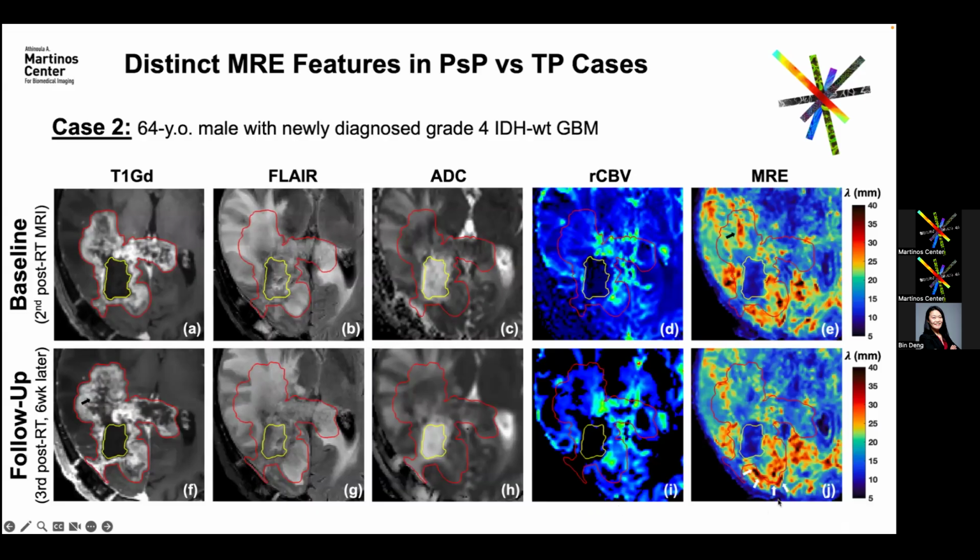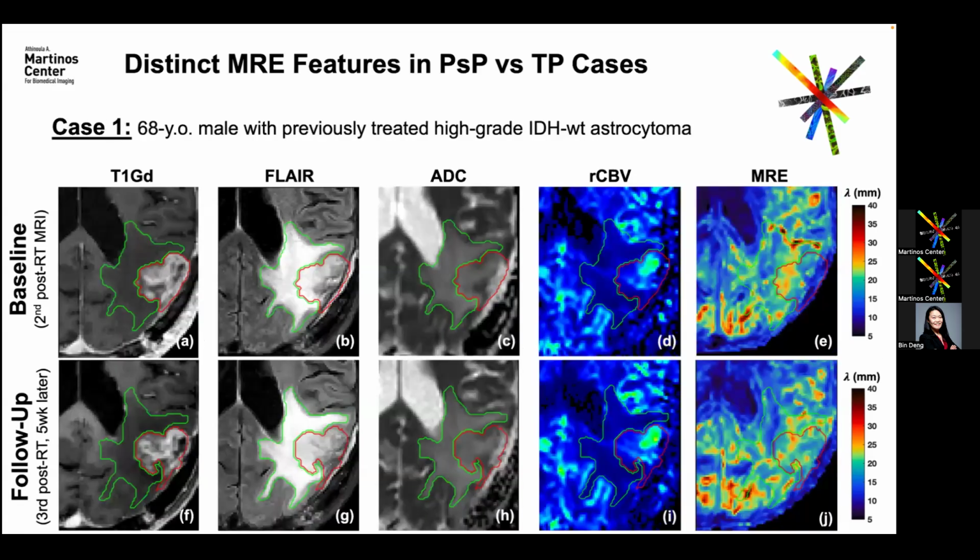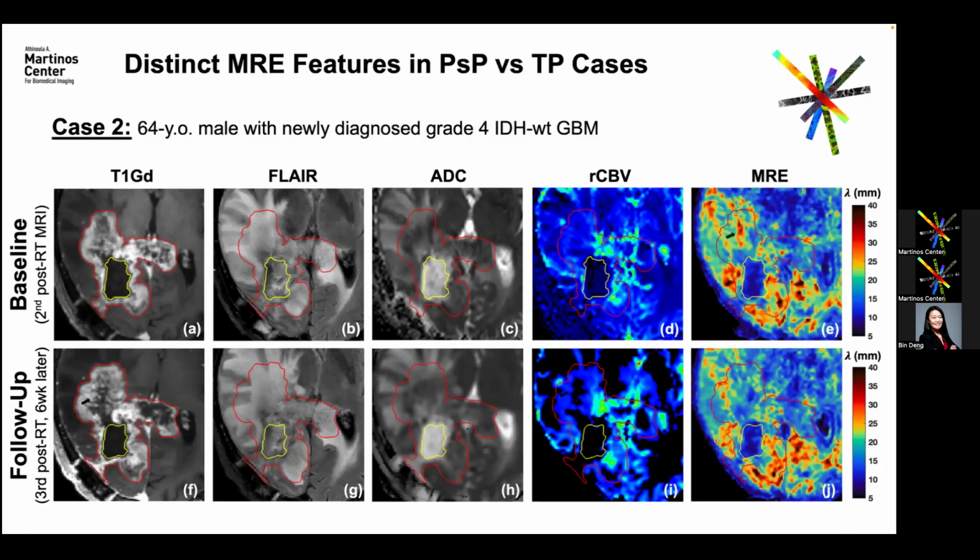We know that as a tumor progresses, there can be accumulation of solid stress. So we're wondering whether this is the solid stress we're seeing. And actually, this part of the tumor did grow quite a bit between the 2 time points. We're still following the patient and want to do more patients and see whether we can draw any quantitative measures to differentiate the 2. But so far it seems quite interesting: just between the 2 cases, we see very distinct features.